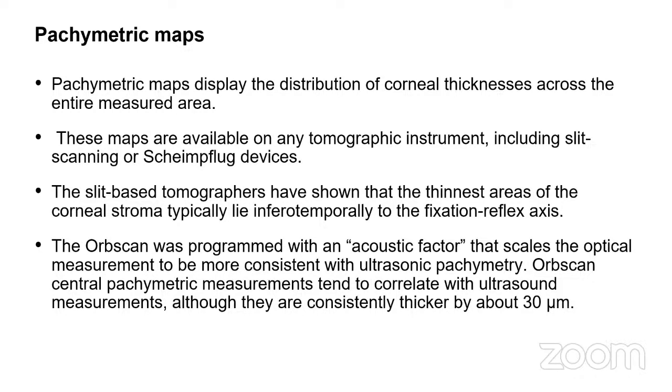The Orbscan was programmed with an acoustic factor that scales the optic measurement to be more consistent with ultrasonic pachymetry. Orbscan central pachymetric measurements tend to correlate with ultrasound measurements, although they are consistently thicker by about 30 microns.